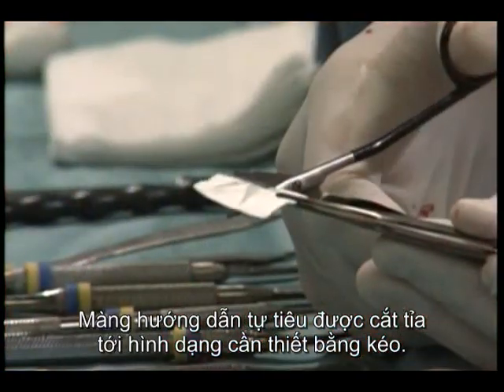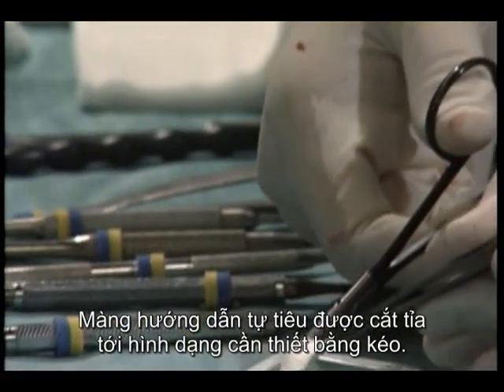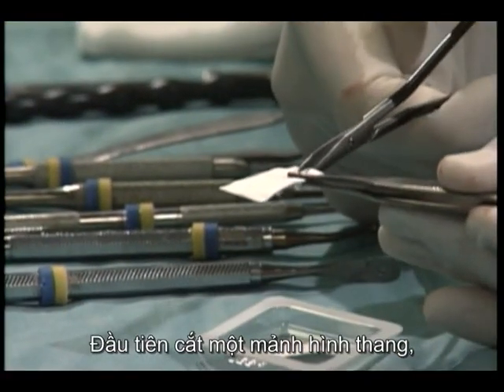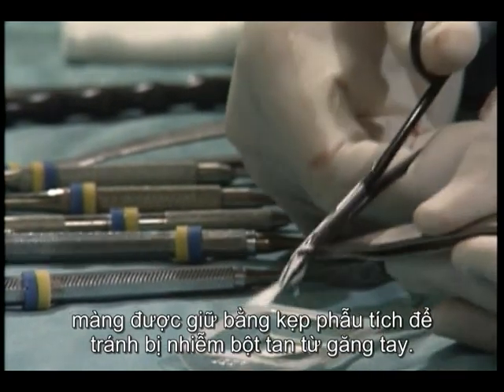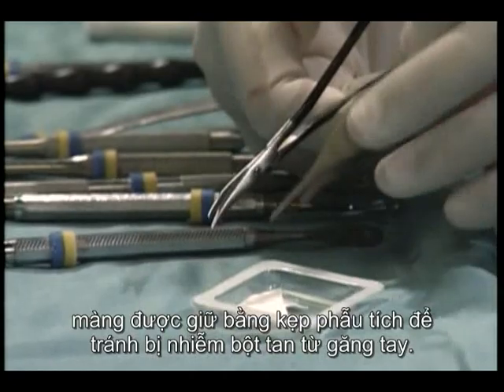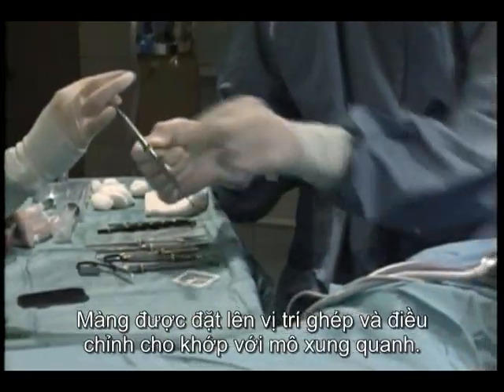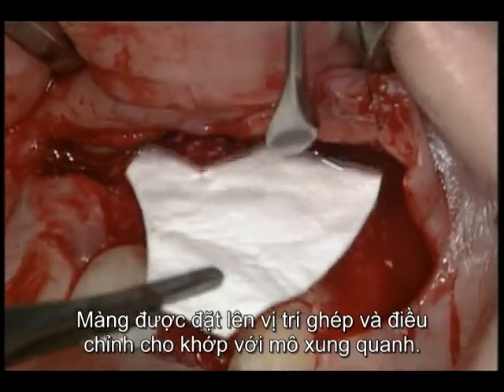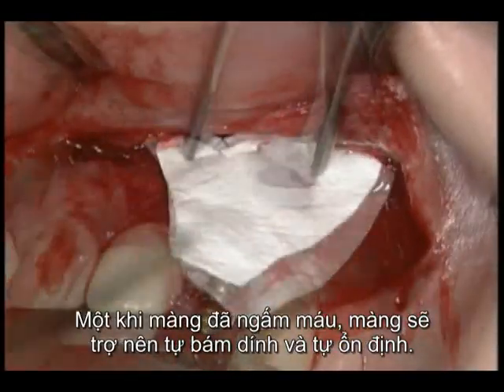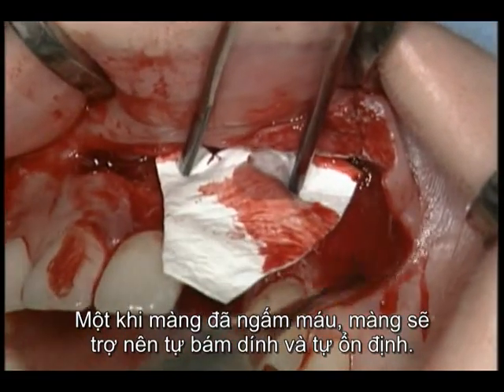A resorbable Bio-Gide membrane is trimmed to the required shape using a pair of scissors. A trapezoidal strip is first cut. The membrane is held with a pair of tissue forceps to avoid any contamination with the talcum powdered gloves. The membrane is placed over the grafted site and adapted to the surroundings. Once the membrane is soaked in blood, it becomes self-adhesive and stabilizes itself.